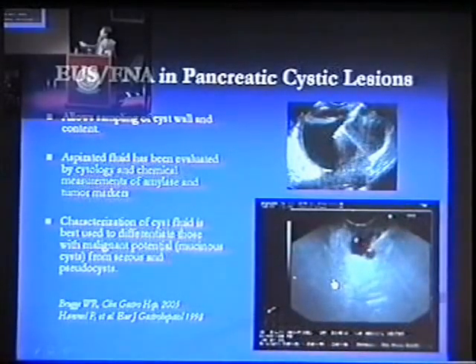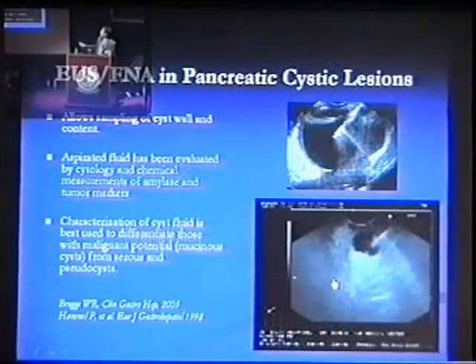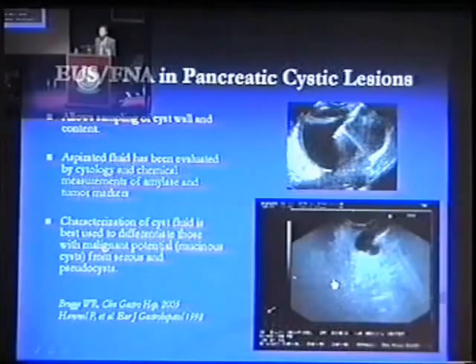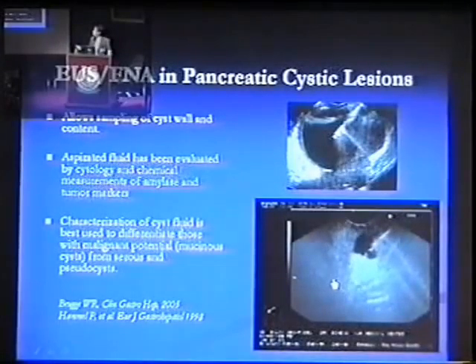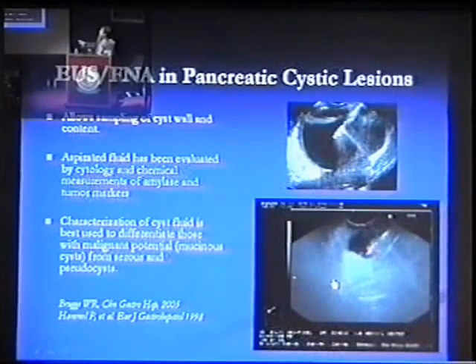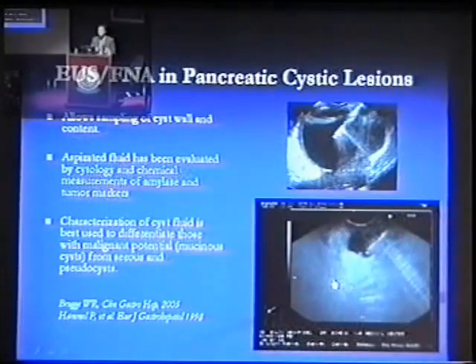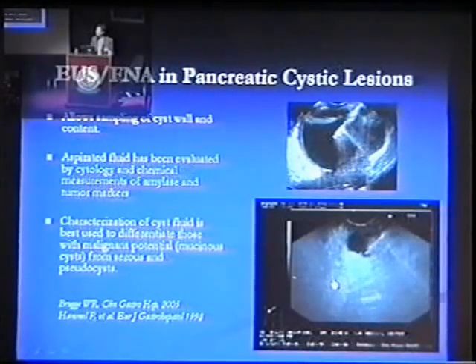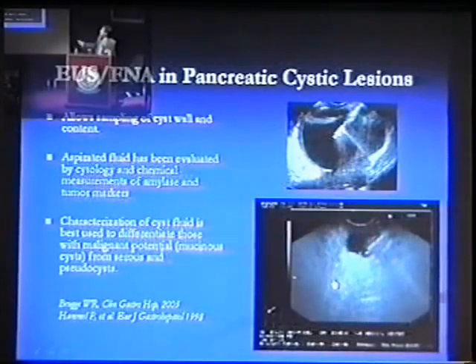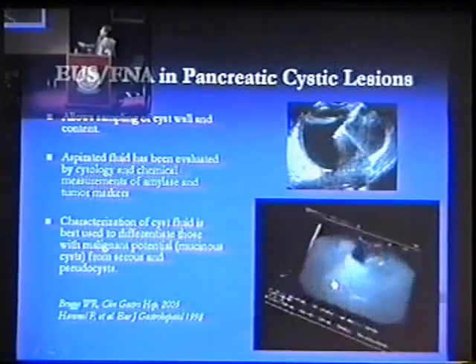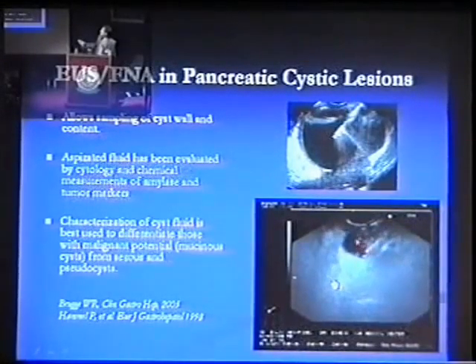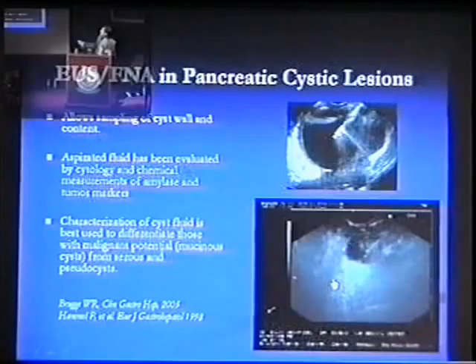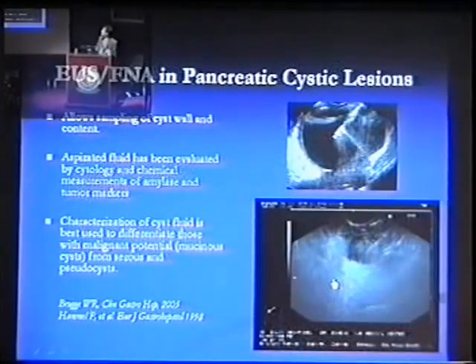This is an example of a small lesion that ended up being diagnosed as mucinous adenoma. You can see the needle being pushed inside this small 2-centimeter lesion. The mucinous content is then drained using this needle aspiration technique, and you can see the amount getting less and less inside the cavity until it is obliterated at the end.